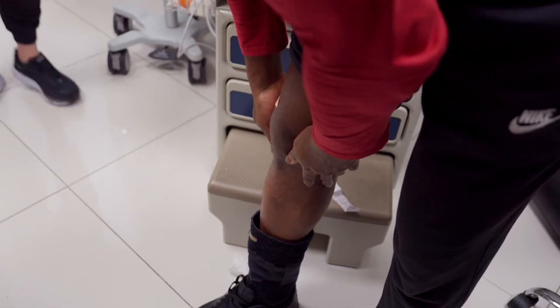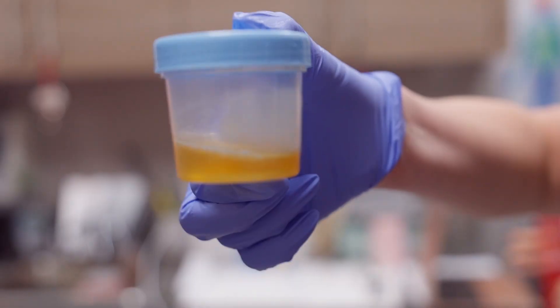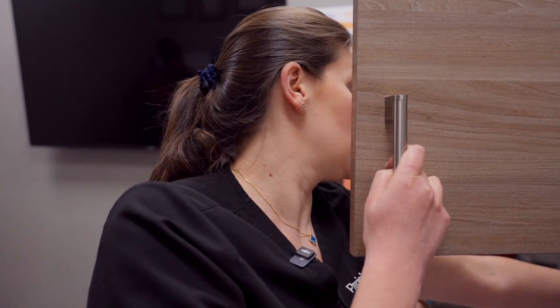Patients sometimes come in with difficulty bending their knee or extending their knee. A lot of times that is due to fluid that builds up in the knee joints, and that we can really monitor or just see through an ultrasound, which we use in the office. Craig usually has some fluid in the knee, so we're gonna see. We'll use our ultrasound and we'll check.